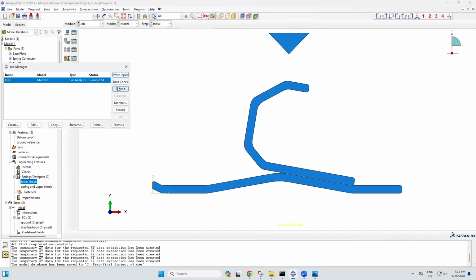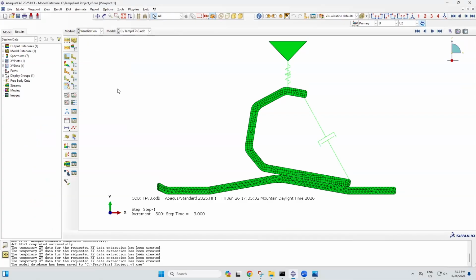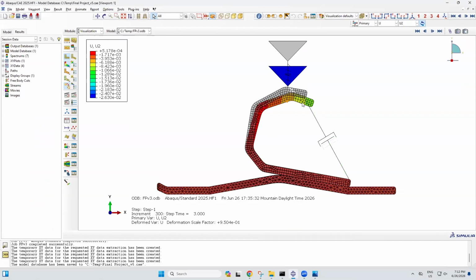Next is job, where I did submit it and run the animation. And I would go to the results and visualization. Here you can see the undeformed, and here's the deformed with the displacements.